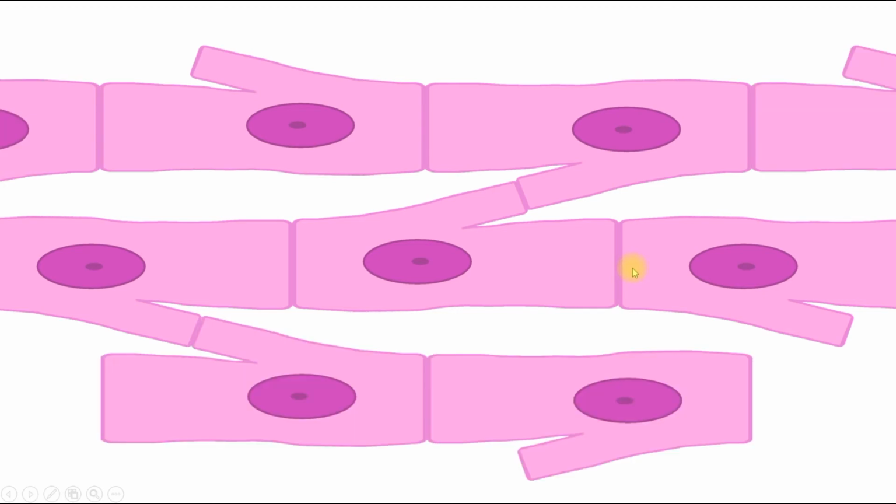They have attachment via anastomosis. Here we can see anastomosis between neighboring rows of cardiac myocytes. So here we can see functional muscular fibers, and they form anastomosis and branching structure of the myocardium. And here we can see this structure, and it provides common contraction of all cardiac myocytes during systole at the same time.